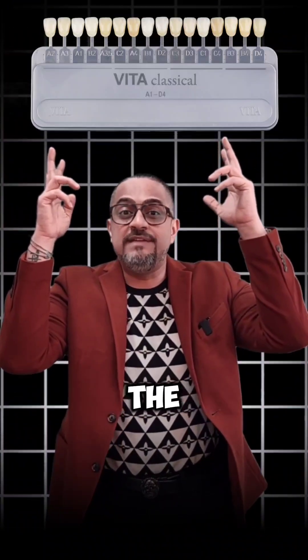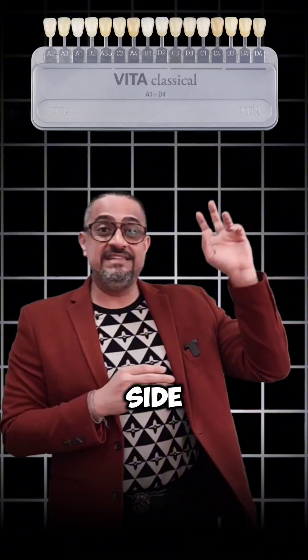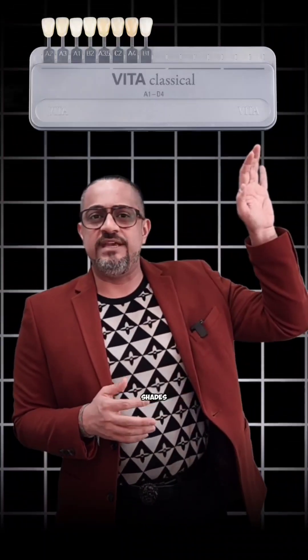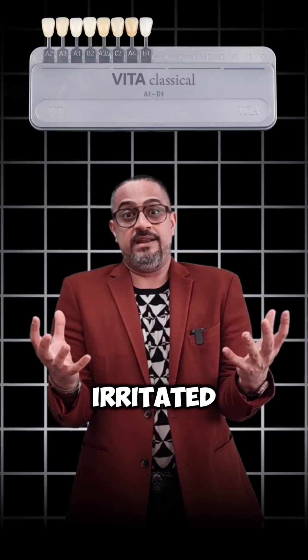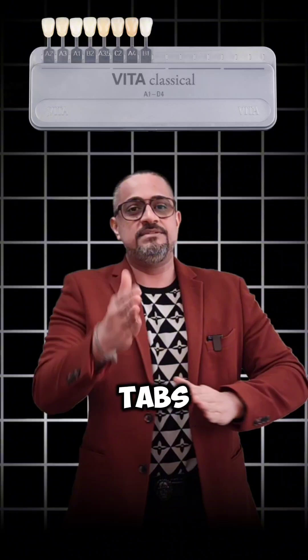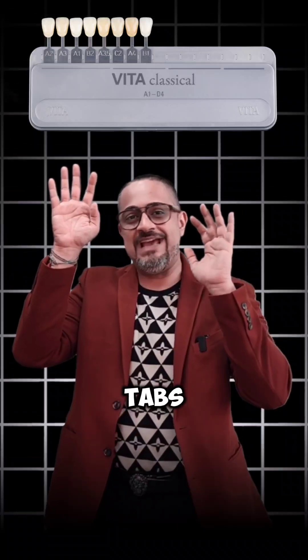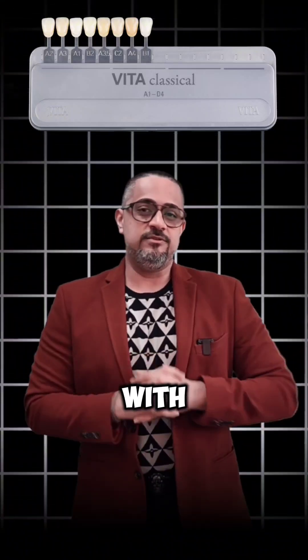I'm going to make your life simpler with the Vita Classic Shade Guide. Here's another arrangement based on the most commonly prescribed shades — most common on one side, least common on the other. We can simplify by eliminating half the shades we normally never prescribe. More choices leads to confusion; fewer shade tabs actually allows you to choose better. Keep only eight shade tabs — don't throw the others away, you might need them occasionally — but work primarily with those eight.